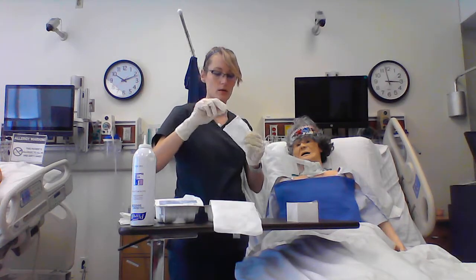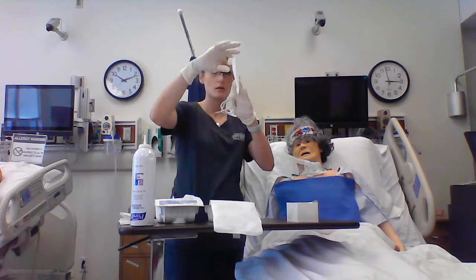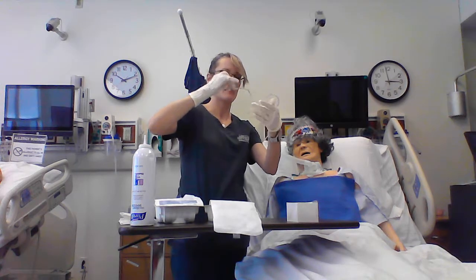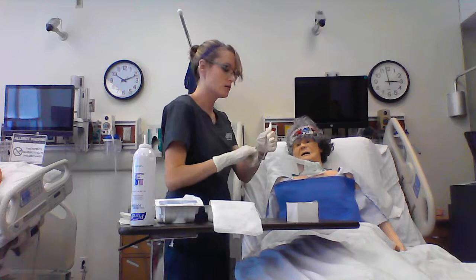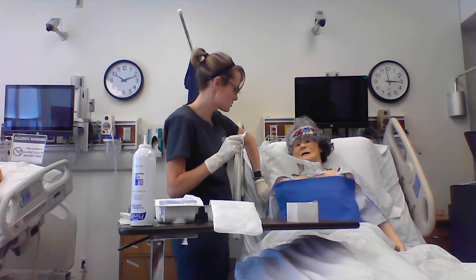You also have a suction catheter in your kit, so take that out of its packaging. And I'm going to wrap that around my hand to gain control of that and let Ms. Opal know we're going to get ready to rock and roll. Go ahead and contaminate your hand and detach your suction.